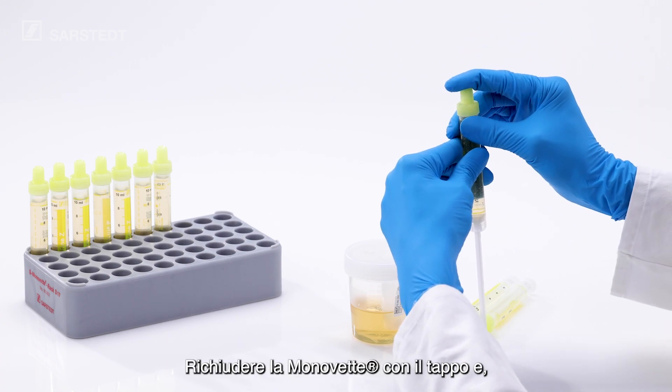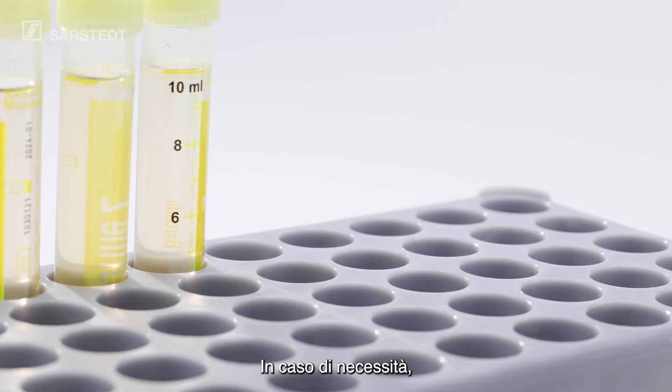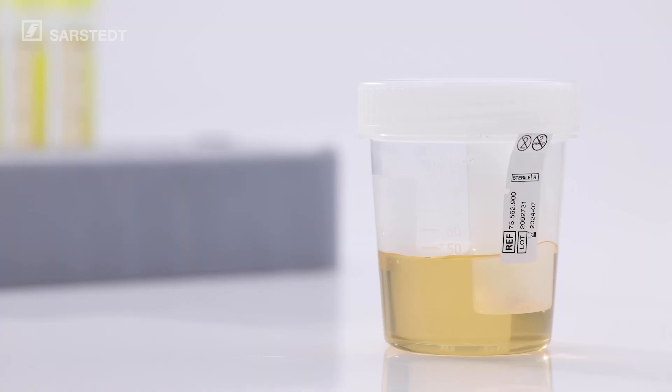Close the MonoVet again with the stopper and then break off the plunger. If necessary, you can take further specimens from the NFT Urine Cup. Finished!